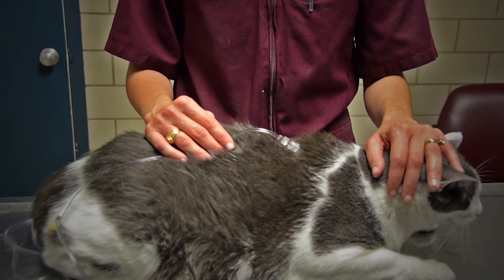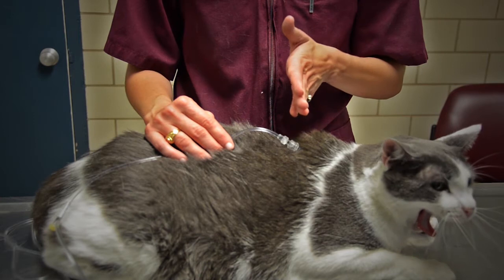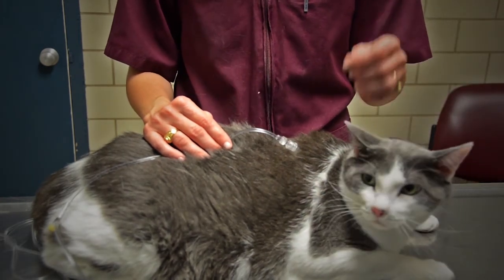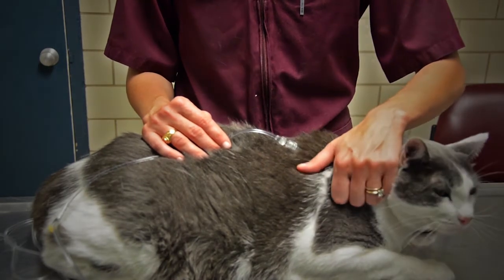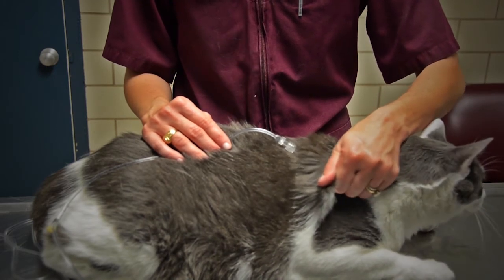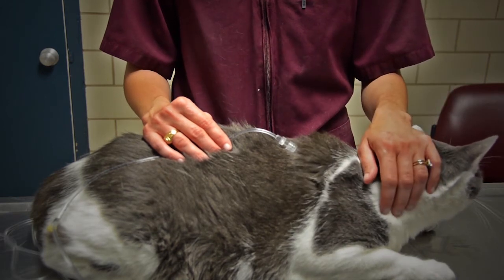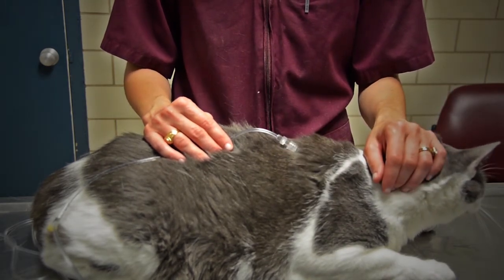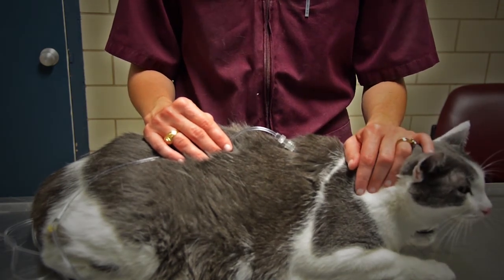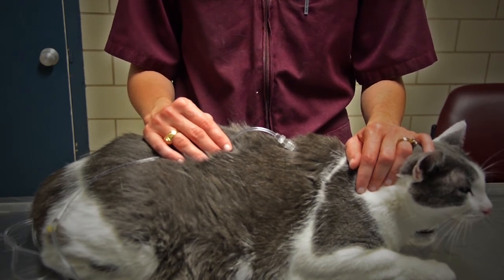Other things that can occur after you put your needle in: sometimes the needle will go in one side and out the other, and you'll get a river of fluid running down your animal. If that occurs, you go on the side where the water is coming out, grab the skin, and pop that needle back up underneath the skin. Give it a good pinch and hold on to it just to keep that fluid from leaking out. Lastly, once you've administered the fluids, when you take the needle out, sometimes you'll get a little bit of blood back, and that's okay. It just means that you went through a bleeder when you entered the skin. Again, just pinch, apply a little pressure, and that blood will stop.